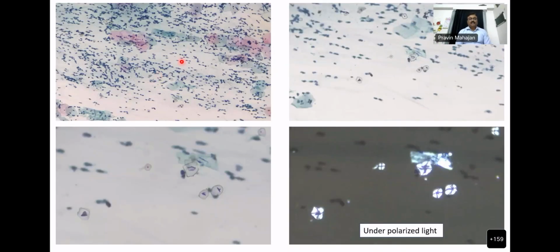This is a pap smear, or a cervical vaginal cytology smear, wherein you can see in the upper left corner image squamous cells of superficial or intermediate type with inflammatory cells. But on high power, you start to see some round, oval or polygonal structures with some very irregular pyknotic-like material inside, which looks like it could be a cell, but doesn't look like a basal or parabasal cell of the cervical epithelium. On even higher power, they look a little refractile, with a very irregular, more darkly stained area in the center.